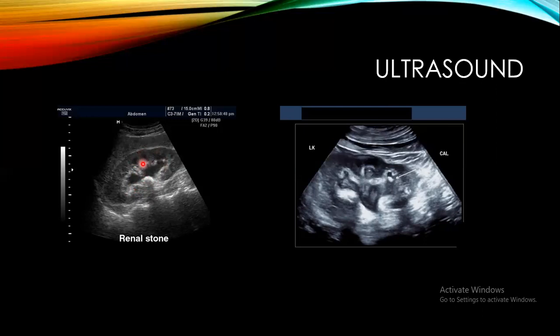So the wave will pass easily within the calyx and within the renal pelvis without any echogenicity. فتشوف دائما الأماكن اللي بيها فلويد مثل البلفس أو المثانة تصير دائما بالألتراساوند تطلع سوداء non echogenic without any echogenicity. بس من تصطدم بالحصوة راح تسوي لي echogenic lesion and followed by acoustic shadow. هذه هي المبادئ العامة البسيطة اللي ممكن تفهموها على ما تعرفون تقرون الألترا ساوند.